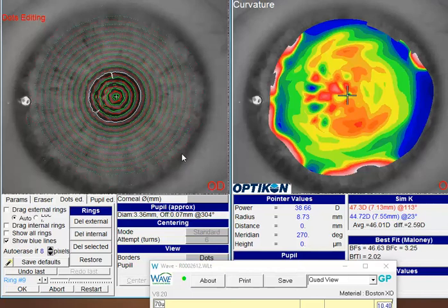Since you are going free form, which I agree with, you can reduce the diameter slightly if you'd like to help reduce awareness out there. And then if you want to make some quadrant-specific adjustments, you can go to the 25 or the 50% quadrant control and adjust that lens up or down to try to account for comfort.